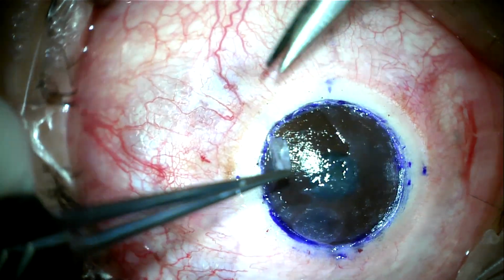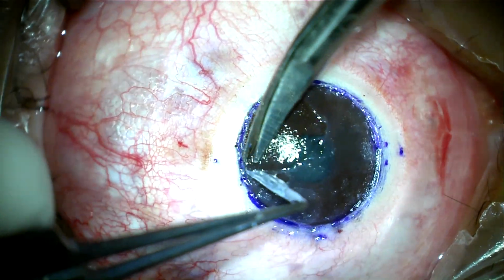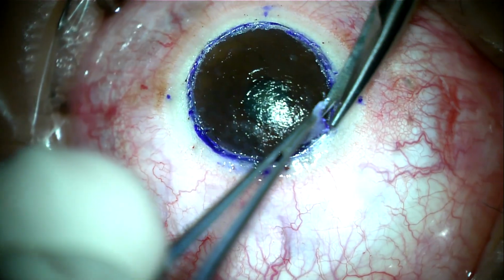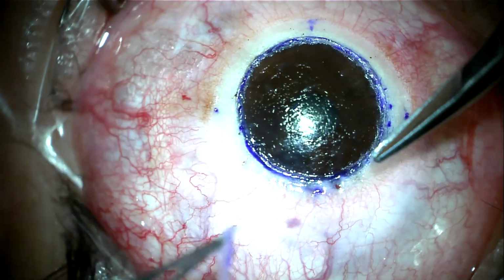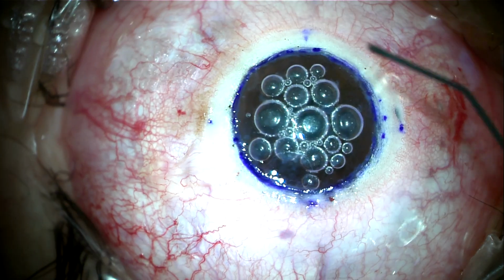Since this is a case of macular corneal dystrophy and the stroma has glycosaminoglycan deposits, it is desirable to remove the whole stroma up to Descemet membrane to have a clear visual access. Air is then injected into the anterior chamber to act as a landmark for the bubble behavior.